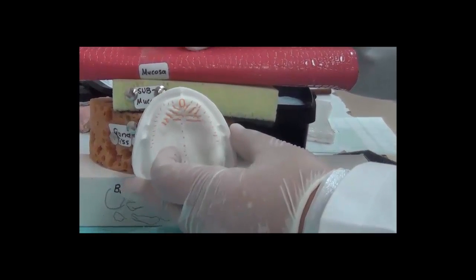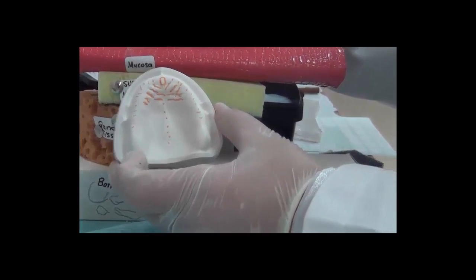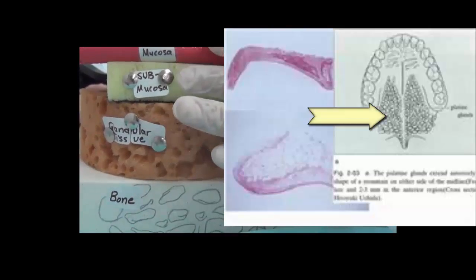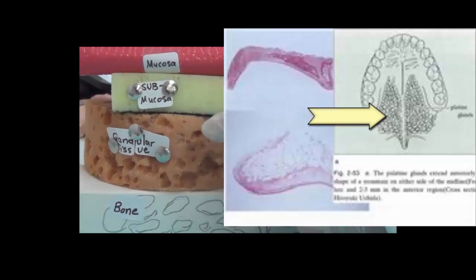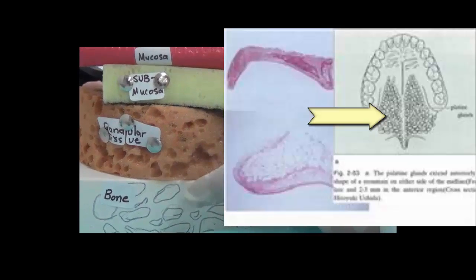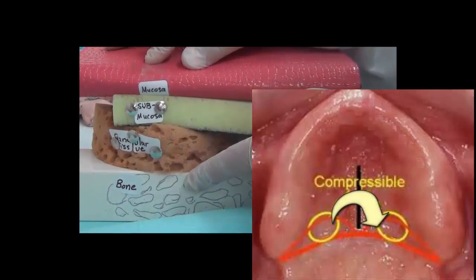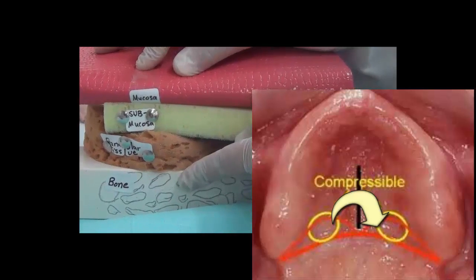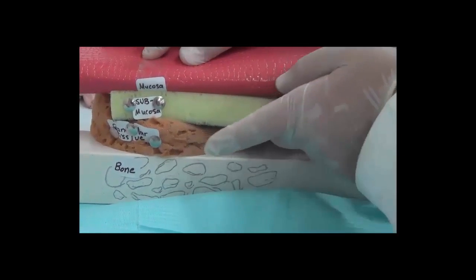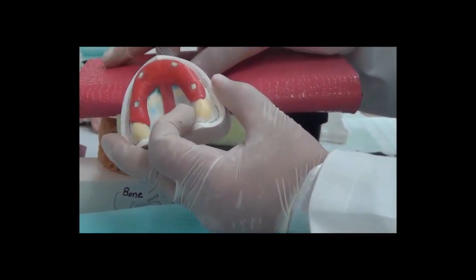The posterior area of the hard palate, which is considered a primary support area, can tolerate pressure for a different reason as well. Other than having good quality of bone and having tissue that is compressible and not very thin, it also has a layer of glandular tissue. This layer of glandular tissue is compressible, and we can compress it in the same manner we compress the rest of the tissue, but we could even press it a bit more by adding something called a post-dam area. So even in this area we exert further pressure, and this is the posterior area of the palate on both sides here.